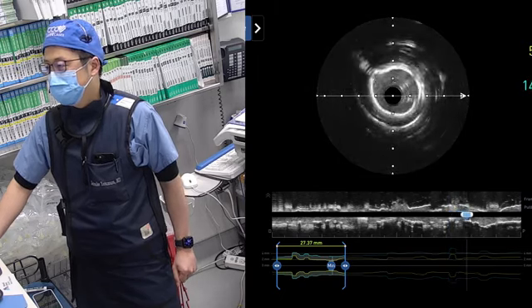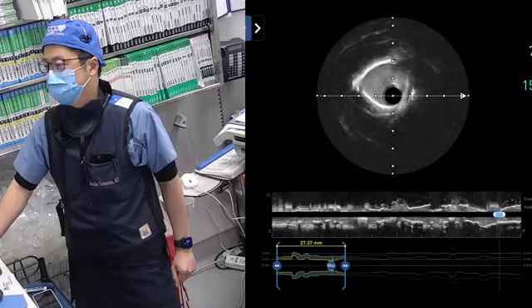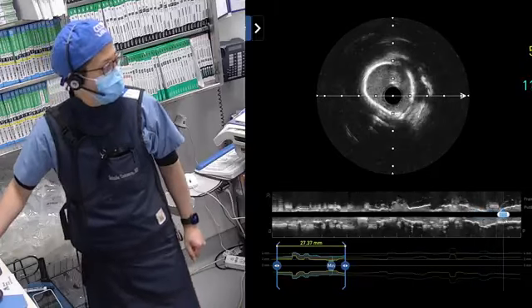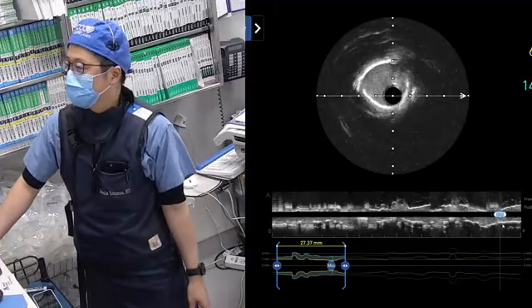I think a high pressure will be okay. And if need to be, maybe just use a cutting balloon. Sure, vessel size was 3.0, I think, right? This all the way distal is 2.8, but it's a huge tapering.